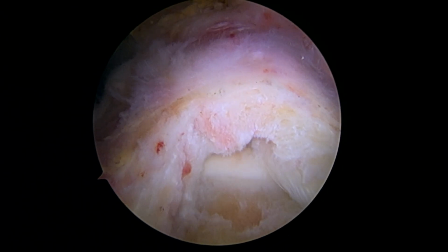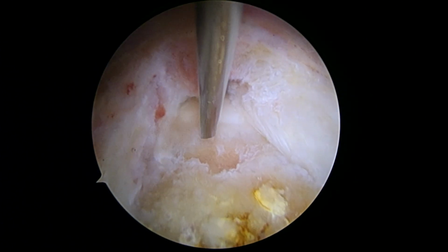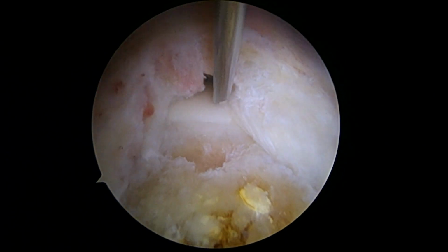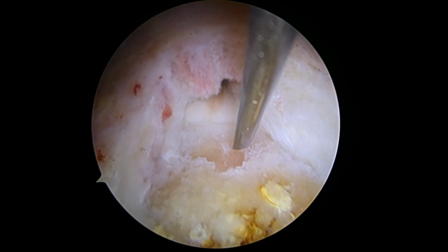Spinal needle. Okay, so here we use a spinal needle just to check our angle of insertion. That's the articular margin. If I kept going down that way, that would go down into the joint. We're going to cheat back maybe 4 or 5 millimeters and place an anchor right about there.